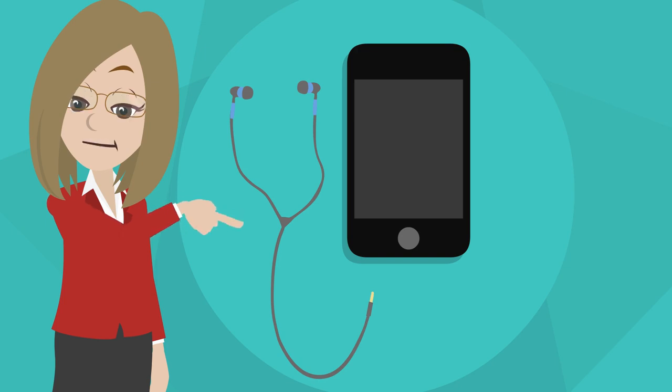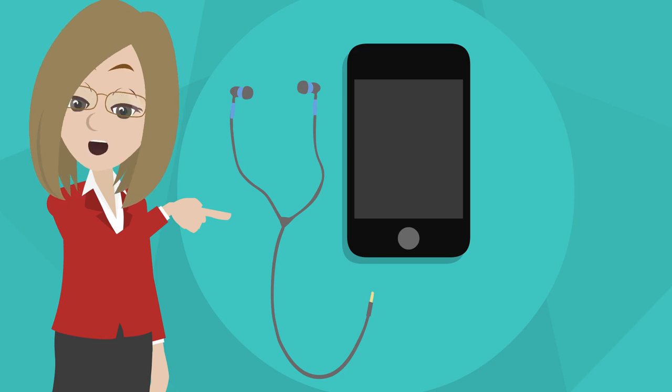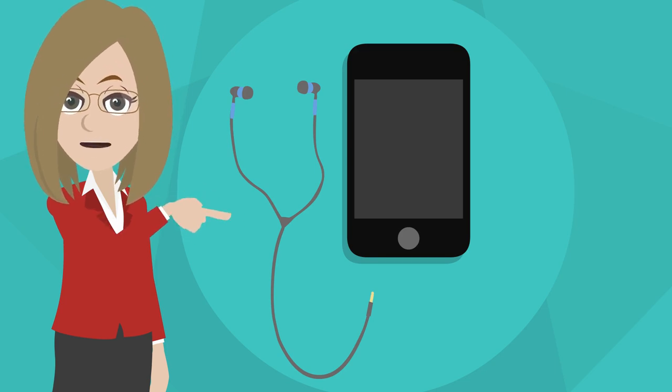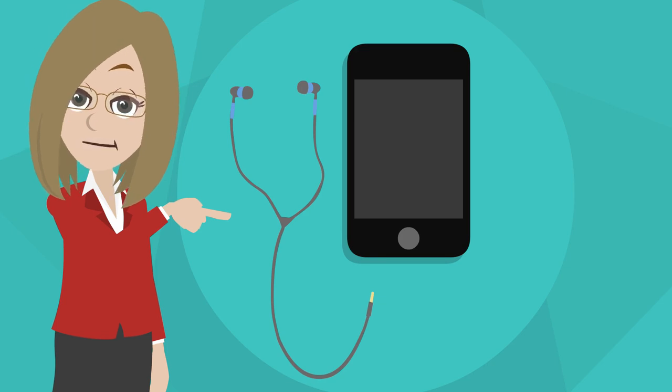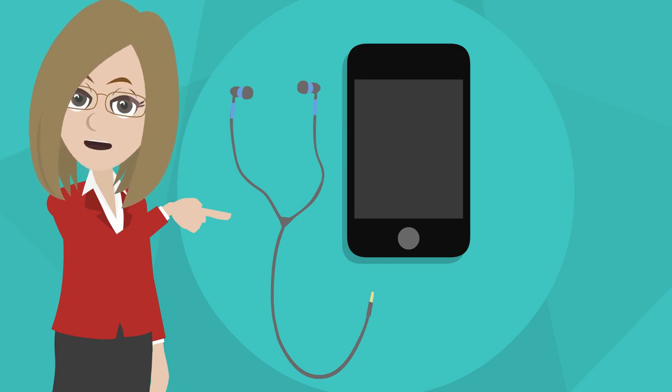A note about headphones. For the best experience, use corded headphones with an inline microphone, like the ones that were included with your device when you purchased it. If you choose to use a Bluetooth headset, keep in mind the sound that plays in your ear may be louder than what the sound would be with the SpeechFive device itself.